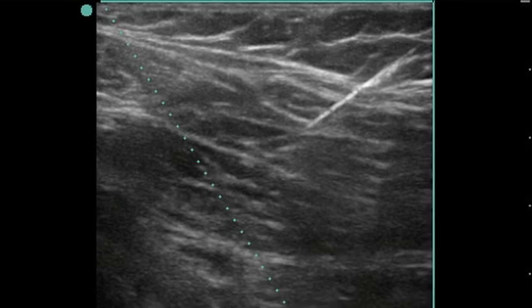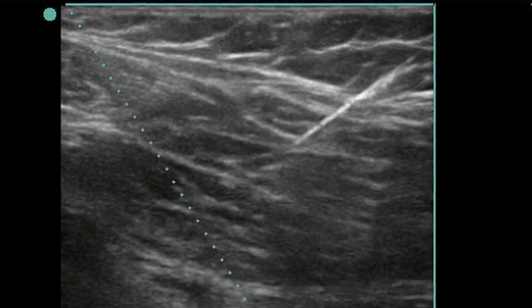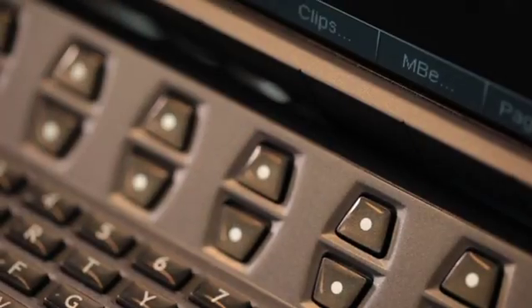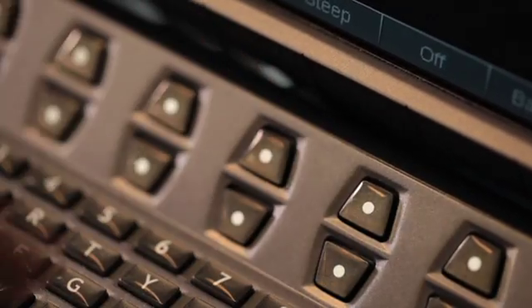It's a very bright, hyper-echoic white line that even an untrained person can see easily. Just pushing one button allows me to see the needle very, very clearly.